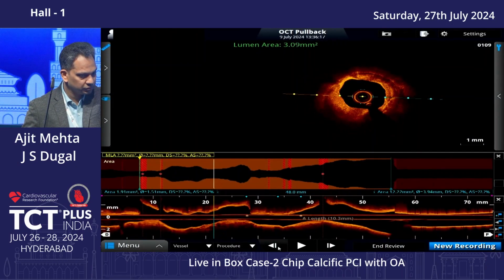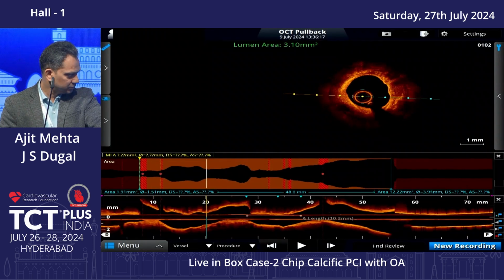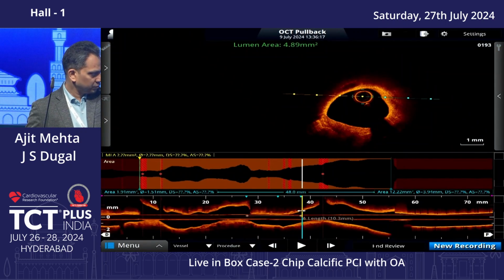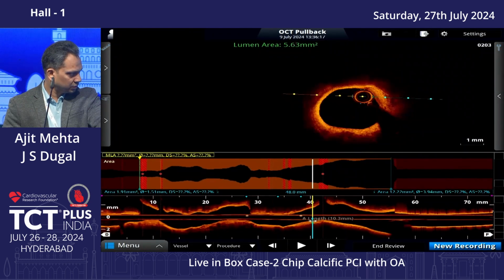Okay, this is here. This is 360. So that is more characteristic than any of the other locations that we're seeing. But it's relatively focal. It's not super long in terms of the 360. And also 360, when you go to the thinnest, I do think that's close to 0.5.